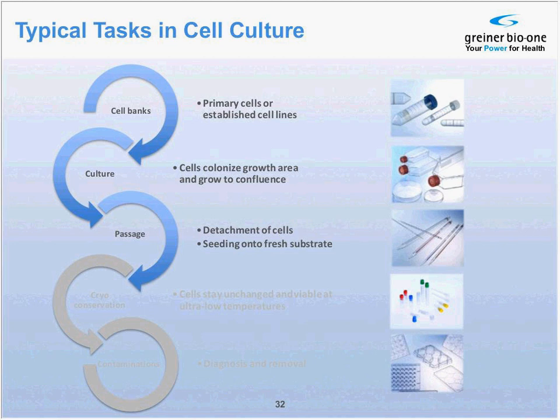Scraping the cells off from the substrate with a cell scraper or digesting the proteins on the cell surface can damage cells and hardly gives a single cell suspension. Enzymes are the best choice for standard subculturing of cell lines. It's very important to apply any enzyme solution to the cells only as long as it is really needed, to not damage the cells.